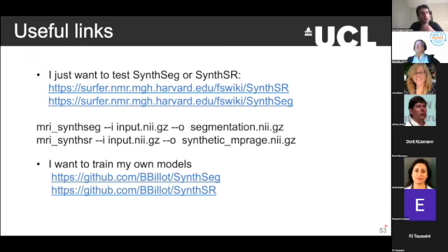For Synth, we do a bit of post-processing, like filling the holes in the segmentation and a bit of this, a bit of that. And that takes maybe 15 seconds on the CPU. It's not easy to port to the GPU, all these morphological operations, like filling holes and stuff like that. They're not that easily parallelizable.